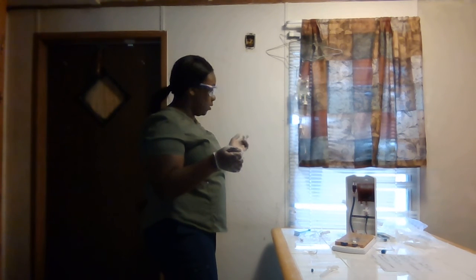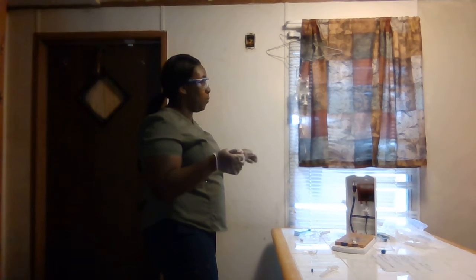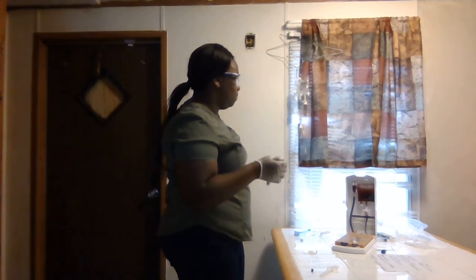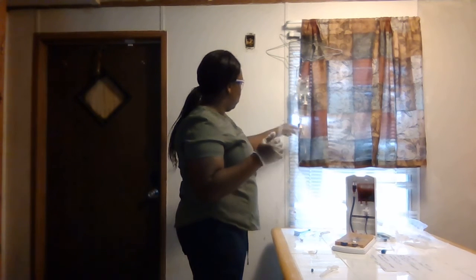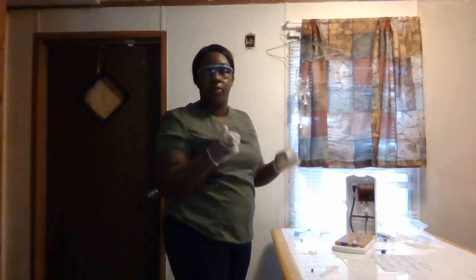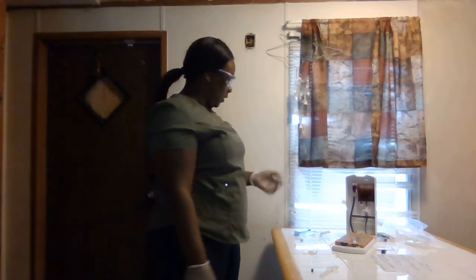Make sure that we enter everything that we needed to enter, program our pump, make sure it's the correct rate and the volume, which is a 50 milliliter bag. Right, and then when we open the roller clamp and press start, it should infuse into the patient. And again, we always want to observe for any adverse reactions.